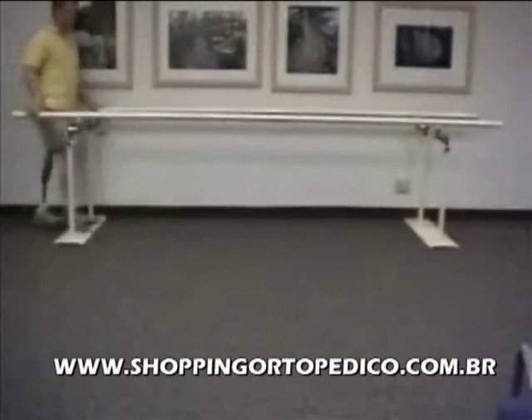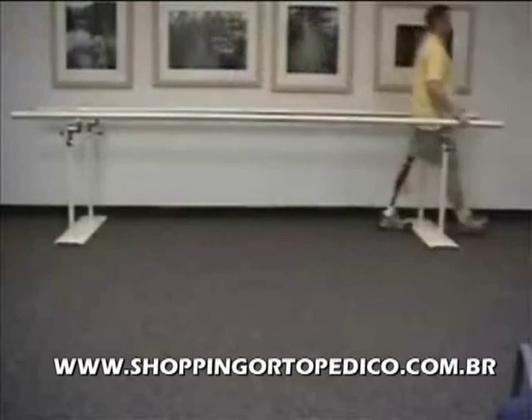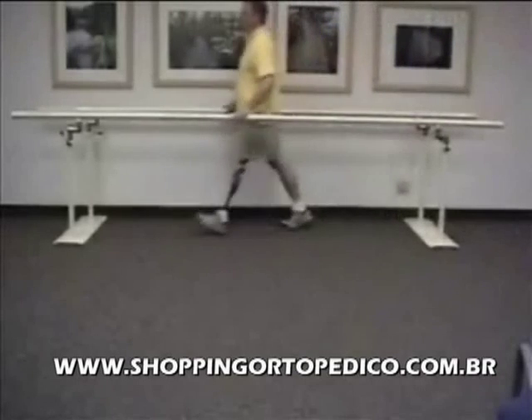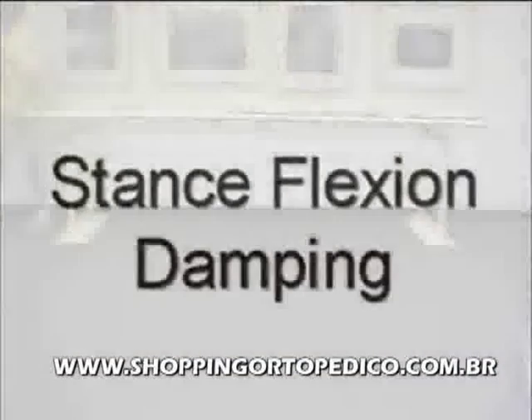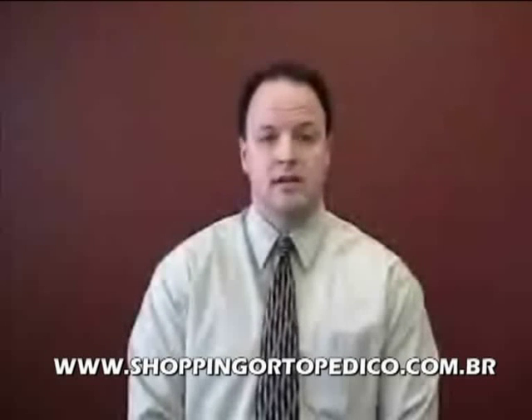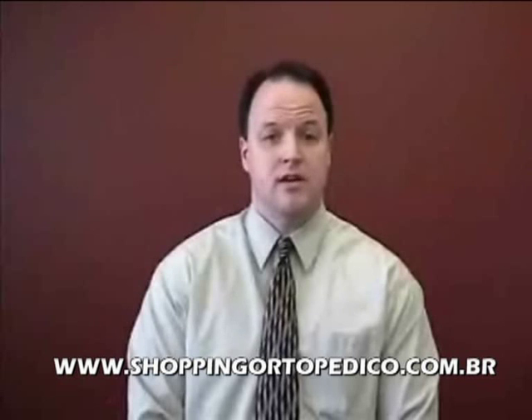Here we can observe a good adjustment of the swing extension resistance. During the process of adjusting the swing phase resistances, the alignment should also be optimized for the individual. The final step in the adjustment process is to adjust the amount of stance flexion damping. This is best done by having the patient ambulate on stairs and declines in a step-over-step fashion.